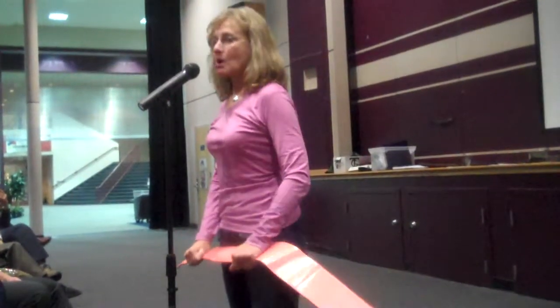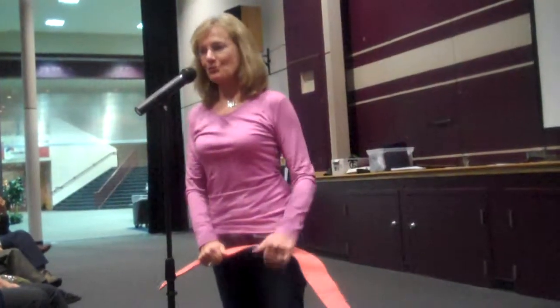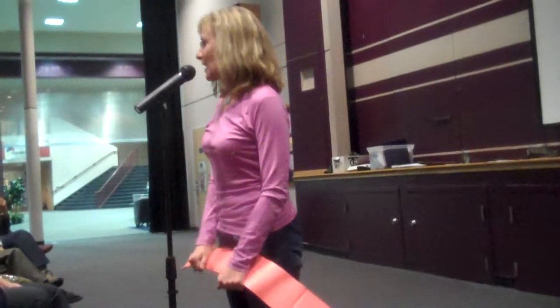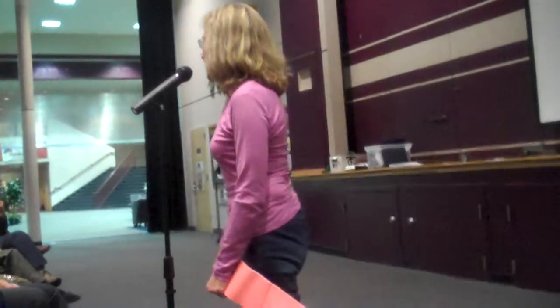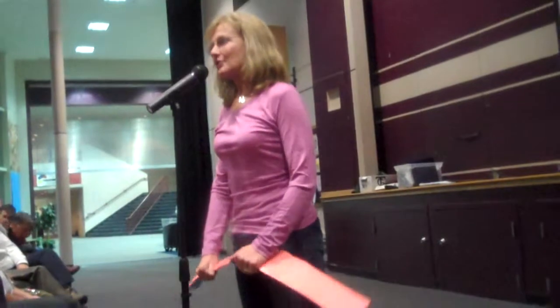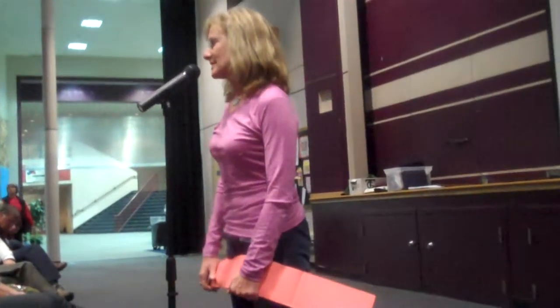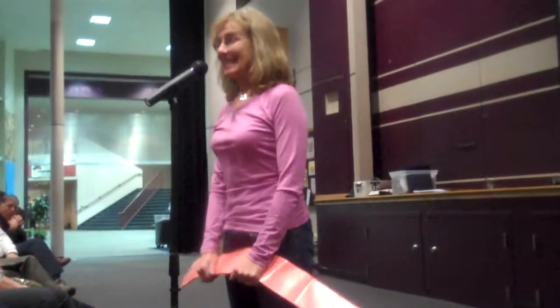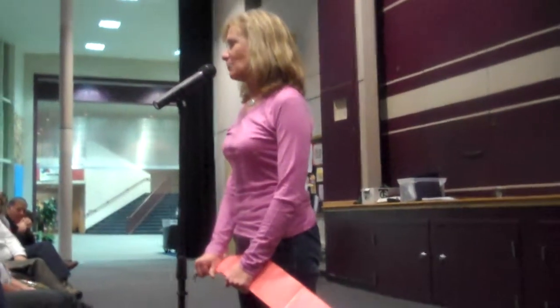When you break into your small groups, you're welcome to have the person you're working on lie down on the floor or sit up in a chair — whichever way you feel will be most adaptable to what you're doing. Remember that tonight is a training session to introduce you to some things you can do with a sand splint. You're not going to be the expert when you leave, so I encourage you to get a sand splint and practice, practice, practice.